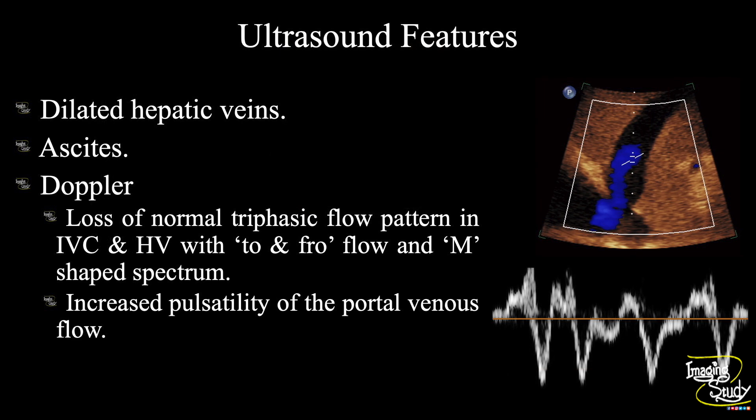In summary, we have seen dilated hepatic veins as well as the inferior vena cava, and there is peritoneal collection or ascites. With spectral Doppler, we have seen the loss of normal triphasic flow pattern in the inferior vena cava and hepatic veins, with to-and-fro flow and M-shaped spectrum. There is also increased pulsatility of the portal venous flow. These features conclude it as a case of passive hepatic congestion due to right heart failure.